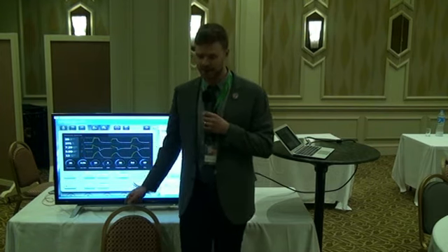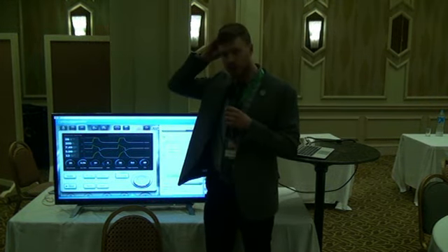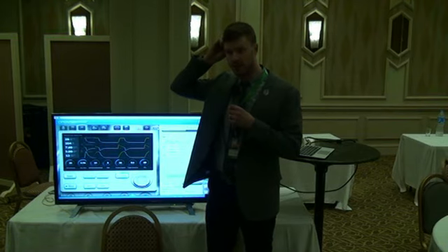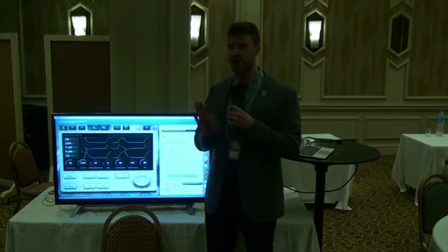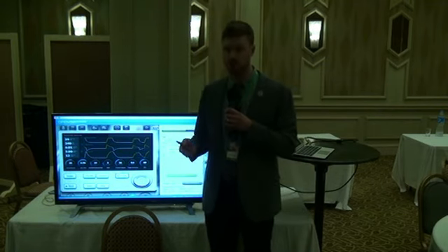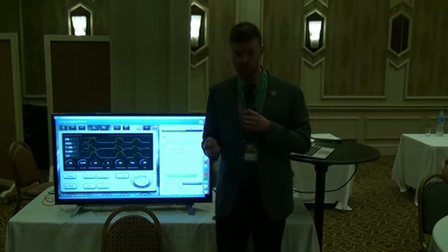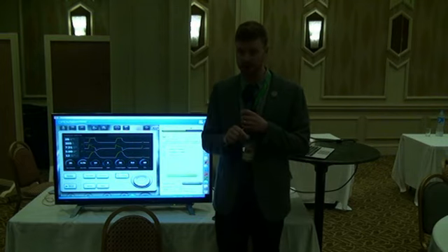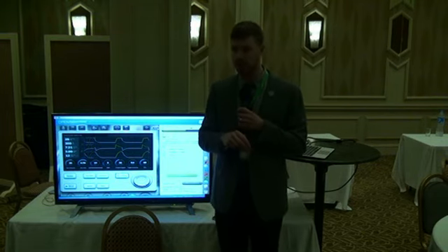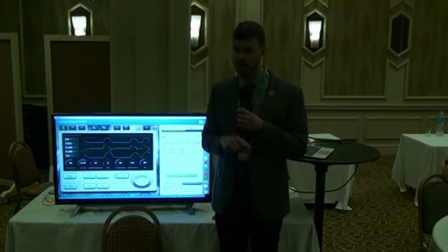Yeah, I think that the way that we approach CO2 monitoring is, in conventional ventilation, our standard of care is always end-tidal CO2. And if we can do end-tidal CO2, that's what we do. I think that it has less problems. It tells you something about the physiology and it has some benefits over transcutaneous. But we do use transcutaneous in select patients. Those being if we have a patient who's a neonate who is too small to be able to tolerate having an airway adapter there that has too much dead space, then we can put a transcutaneous monitor on that child.